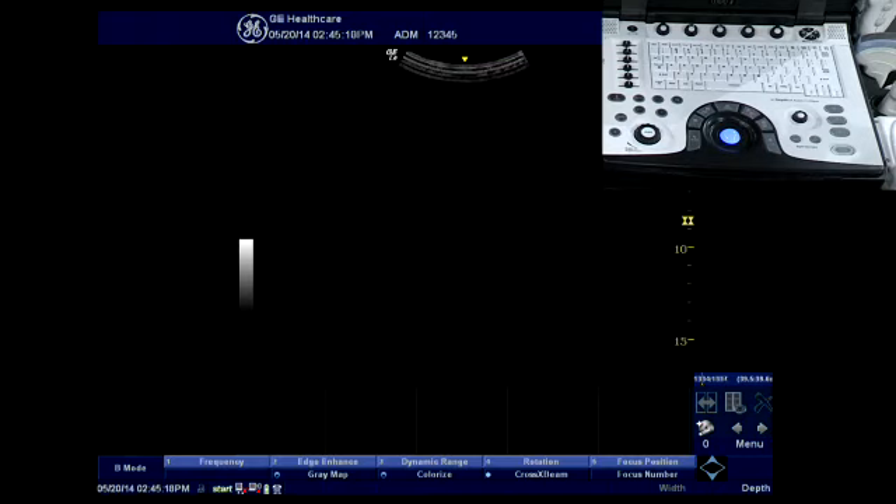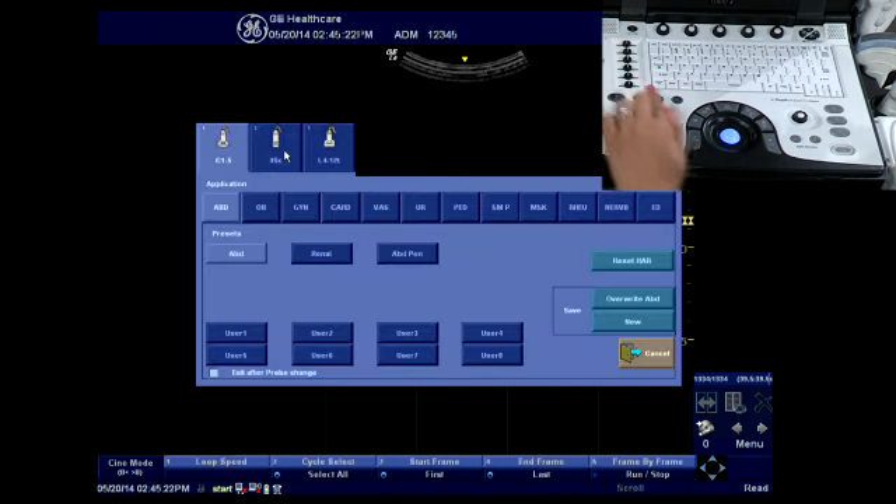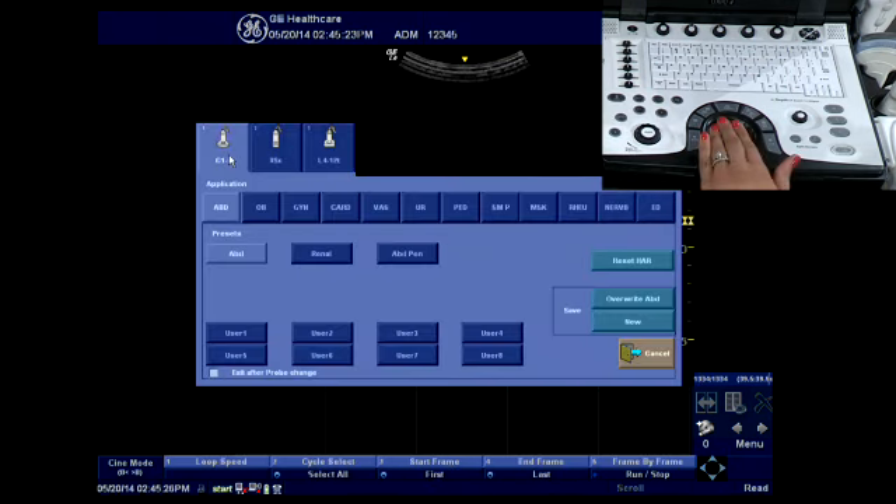To select your transducer and exam type, you will press the exam button. This brings up an on-screen menu with your different probes that are plugged in, as well as file folders for different exam types.